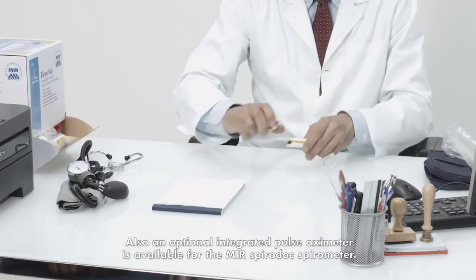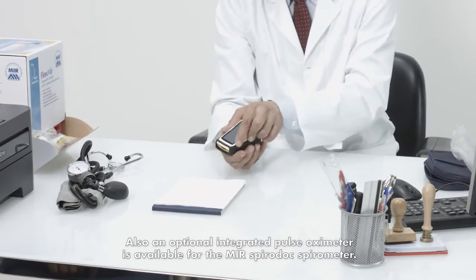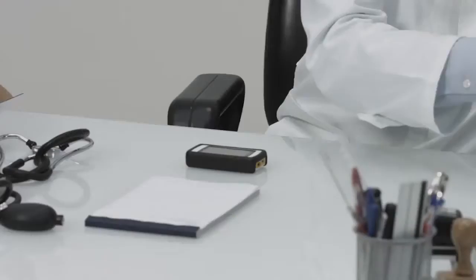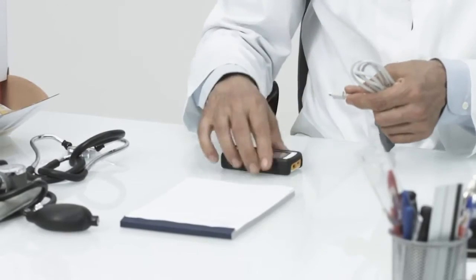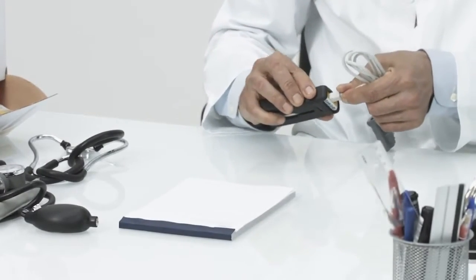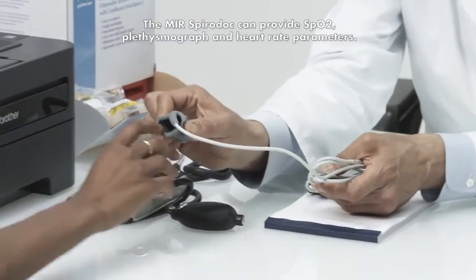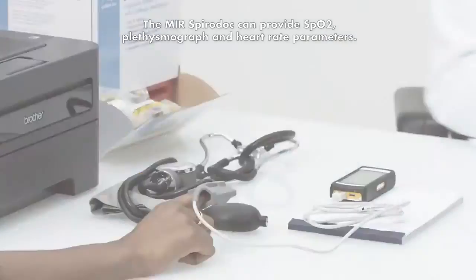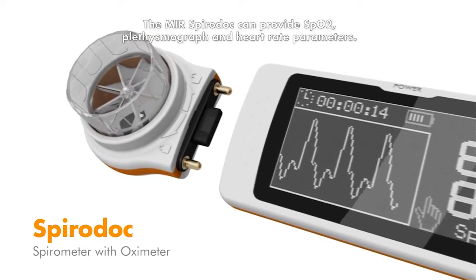Also, an optional integrated pulse oximeter is available for the MIR SpiroDoc Spirometer. The MIR SpiroDoc can provide SpO2, plethysmograph, and heart rate parameters.